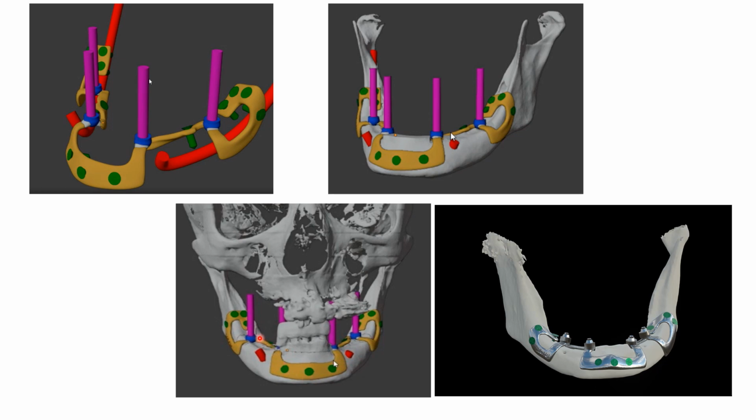Nowadays they are no longer called subperiosteal implants but are called individual custom implants for patients where there is no alveolar bone available to place endosteal implants, or in patients who have undergone trauma or radical dissection to remove cancerous bones and tissues. So in such cases, these implants are then designed and then milled using titanium or laser sintered using titanium alloy.